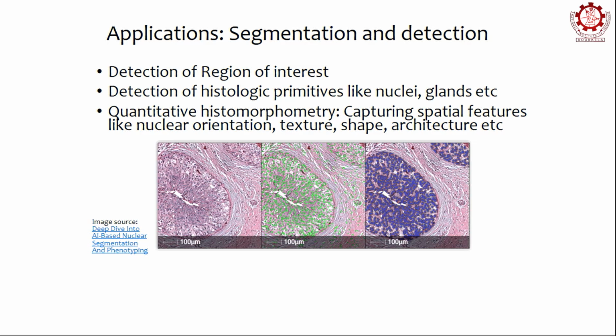Also, when you look at pathology reports, you will find terminologies, like pathologists will tell you these nuclei are rounded or these are elongated. Now, you can always give them an automated report that would tell them, okay, this percentage of the nuclei of interest are rounded or elongated, and they can always verify that with their own analysis, and that's how you would validate your AI model.